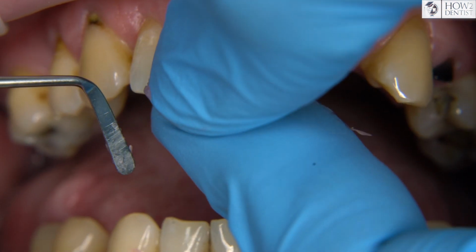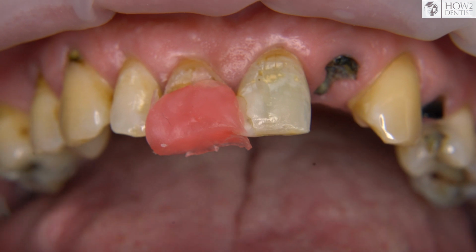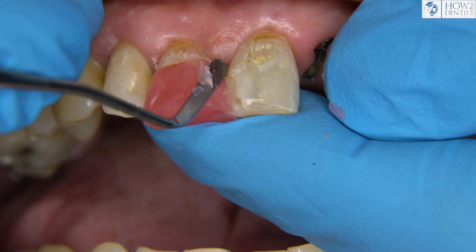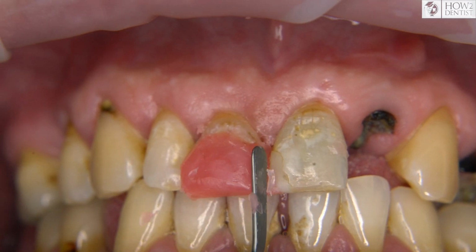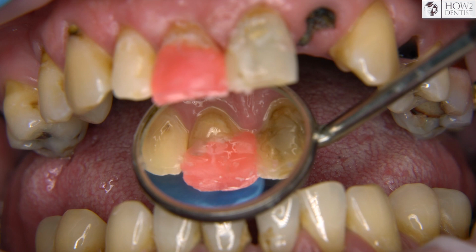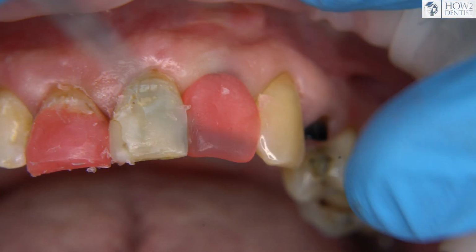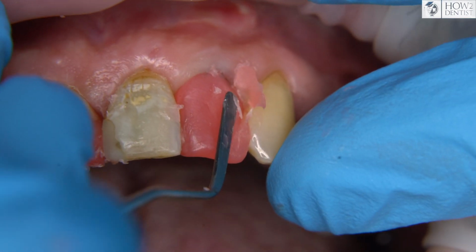One way to make a hint of aesthetic temporary rehabilitation of the patient is to first make a model of the future restoration in the mouth using a direct wax method and make temporary crowns using this template. To do this, take the usual base wax, warm it up a bit and form an approximate outline of the future restoration. We want to note that this is also one of the most budgetary methods, as even the cheapest composite is more expensive than wax, and you are not limited in time.